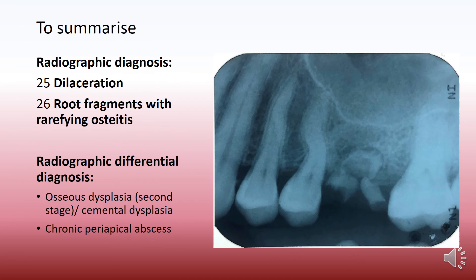To summarize the radiographic diagnosis: 2-5 is a normal tooth but has root dilaceration. 2-6 are root fragments with rarefying osteitis. The radiographic differential diagnosis would be osseous dysplasia, also called cemental dysplasia or cemento-osseous dysplasia, or simply a chronic periapical abscess.